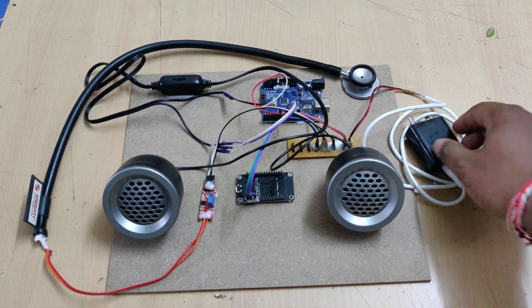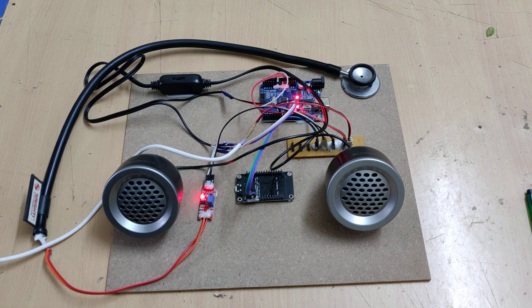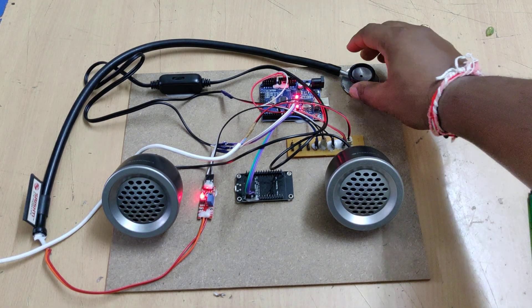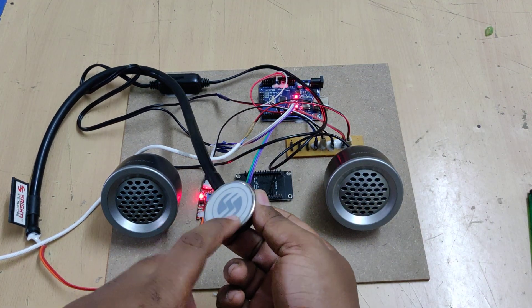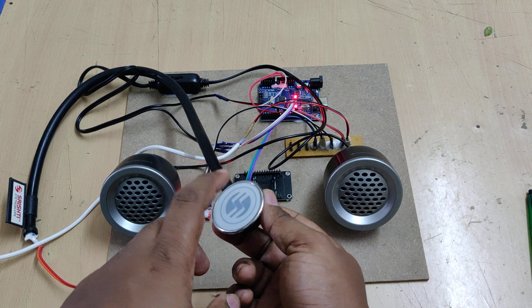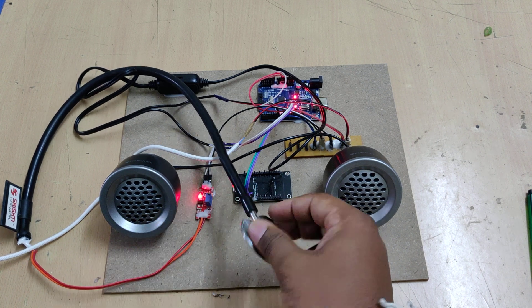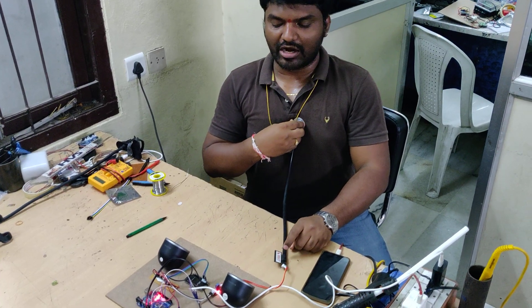Let us see the demonstration. Switching on the power supply to the adapter — it reads normal. Now let us place the stethoscope directly on the body, on the chest, to capture the heart system.